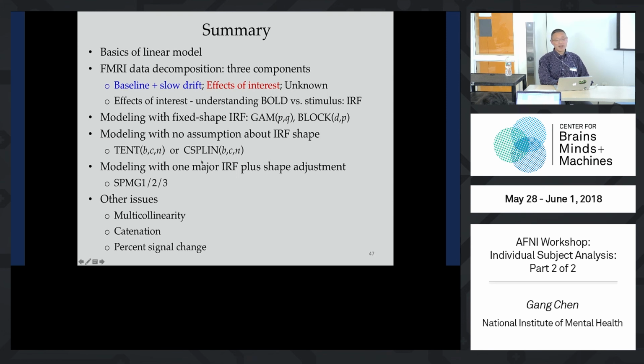Also, I want to emphasize that in AFNI, that's another subtle difference between AFNI and other implementations, if you use multiple basis functions, your stimulus timing does not have to be synchronized with your TR. It can be anything. TR is when the scanner acquires each volume, right? The beginning of each acquisition. So the stimulus timing, the events or trials, don't have to start exactly at the beginning of the TR. They can be anywhere, even if we use this approach.